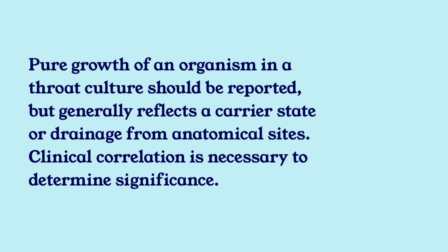This is why organism predominance in a culture is so important in clinical microbiology. The pure growth of an organism in a throat culture should be reported, but it generally reflects a carrier state or drainage from other anatomical sites. Clinical correlation is necessary to determine significance.